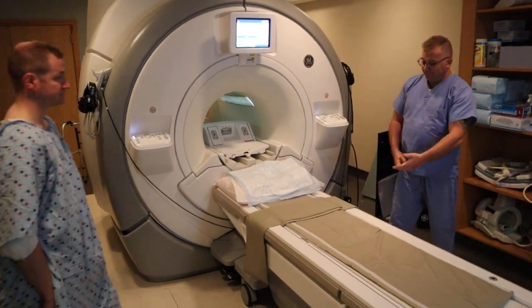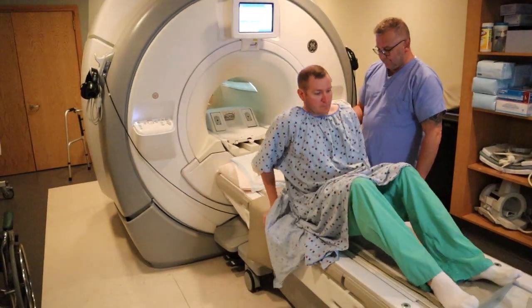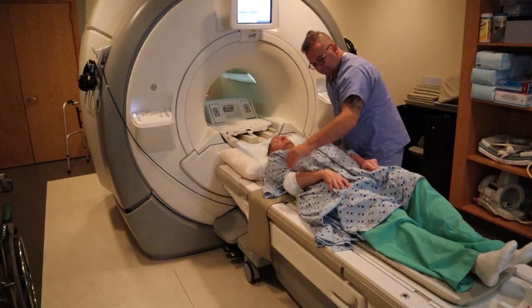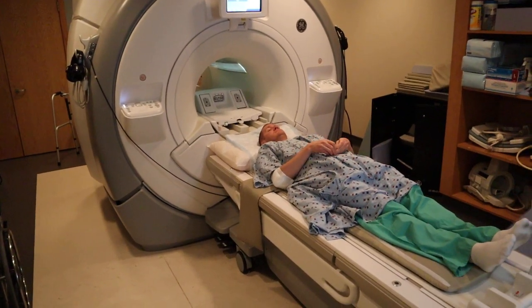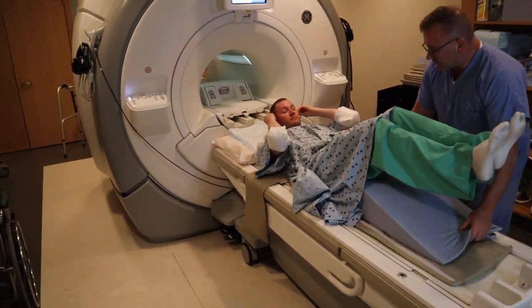We're now going to position for an MRI of the shoulder. You're going to welcome the patient onto the table and we're going to be using a dedicated shoulder coil. If you're scanning the right shoulder, you want to ensure that the patient is offset to the left side of the table. Provide lower back support to limit any motion.